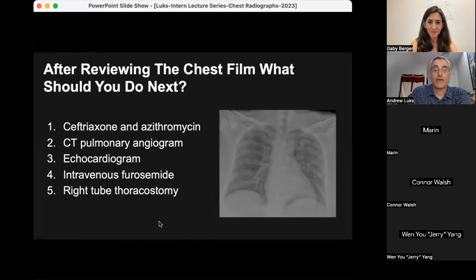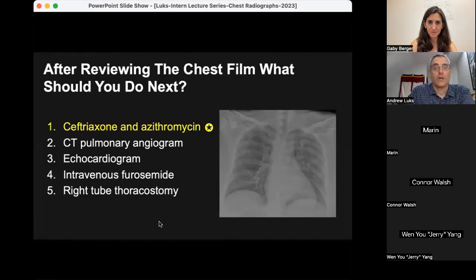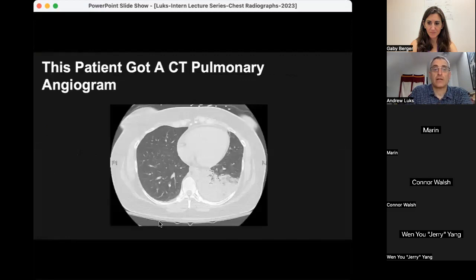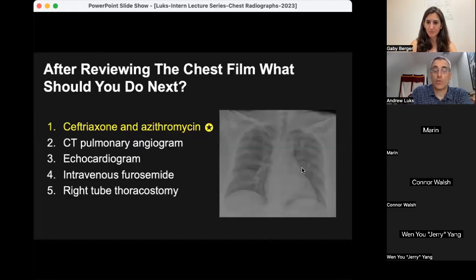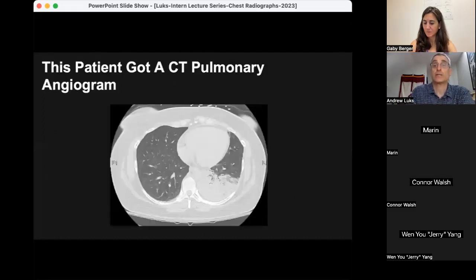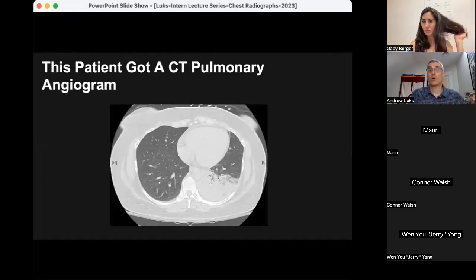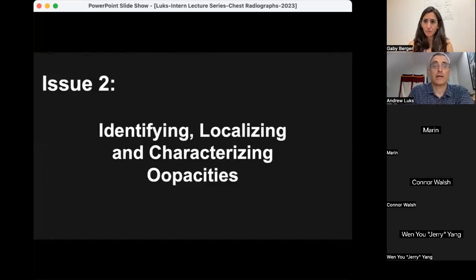The majority — or plurality — of people went for the correct answer: start ceftriaxone and azithromycin, because this patient most likely has pneumonia. It turned out this patient did get a CT pulmonary angiogram because people didn't recognize the key finding on the chest radiograph. The CT nicely showed a retrocardiac opacity consistent with pneumonia, but it was actually present on the chest film — the CT pulmonary angiogram was probably not necessary in this case.